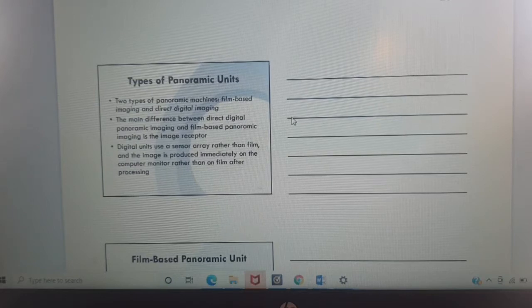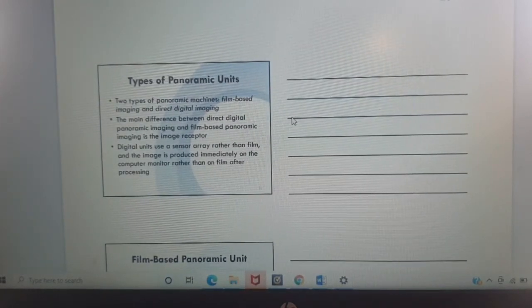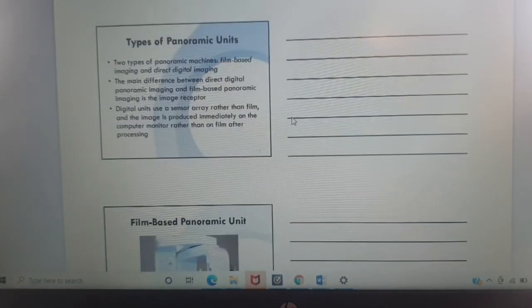This is because they are connected by bars extending from the top of the machines, and they tend to rotate at the same speed. So as a result, we find that the x-ray essentially extends from one condyle to the other, as I had mentioned before, and this may cause a bit of overlap and a loss of detail, but it is great when we want to assess all the other extraoral details as opposed to the more minute details that we can maybe achieve with a periapical x-ray.